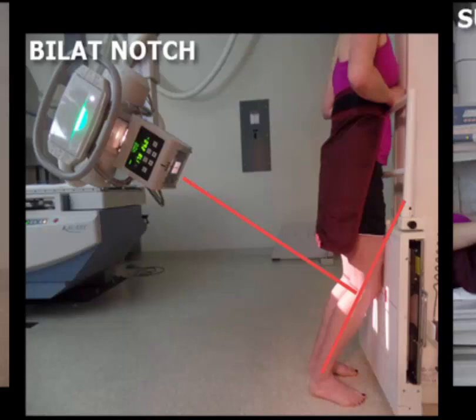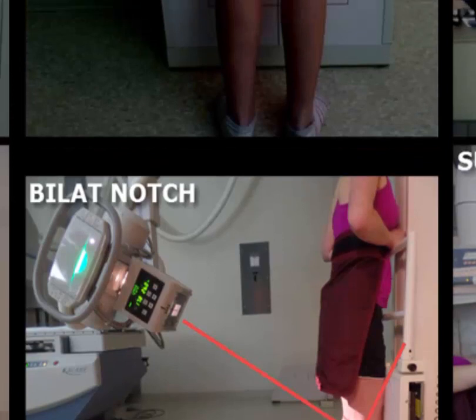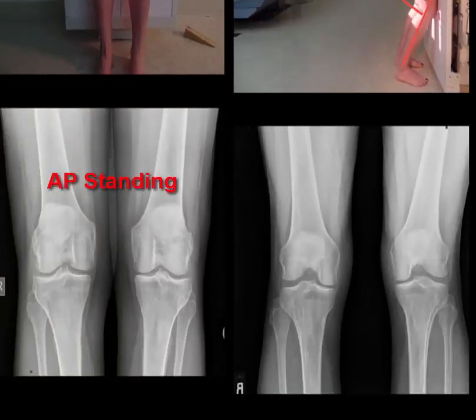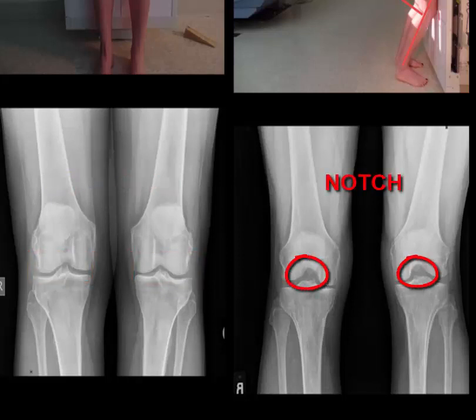The key element here is to make sure the central ray remains perpendicular to the tib fibs. The central ray should exit approximately 1/2 inch distal to the apices of the patellas. Once again, you will want to ensure you have proper marker placement, both right and left. Now let's compare the bilateral standing to the bilateral notch views. Notice the difference. In the notch views, the intercondylar fossa has been opened up, as seen here.